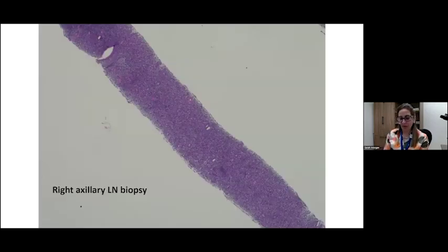So I will talk now about the second lymph node, and I'll tell you why. The first lymph node biopsy that I got in early October was insufficient for diagnosis, and I'll get into the details later. So I asked for a re-excision, a lymph node excision, but unfortunately, it's very hard to book the OR in our hospital. So I got another core that was much better than the initial one, and I'll show you the findings that I had.